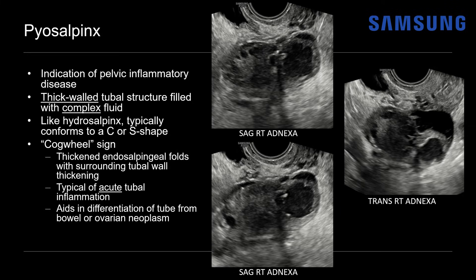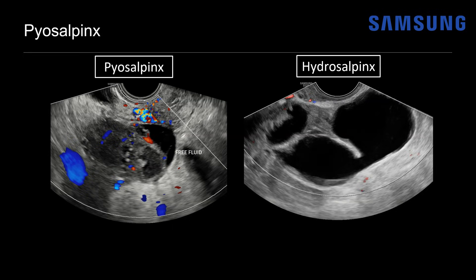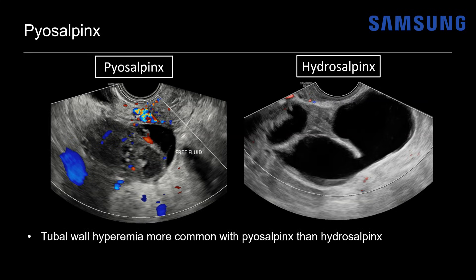Comparing back to the second hydrosalpinx case with color Doppler, there wasn't much flow, but with piosalpinx we do see increased flow about the thickened wall because this is an active inflammatory process — tubal wall hyperemia is more typical of piosalpinx. It's also common to see associated oophoritis, which is inflammation of the ovary, and when the tube is adherent to that ovary we describe it as a tubo-ovarian complex.